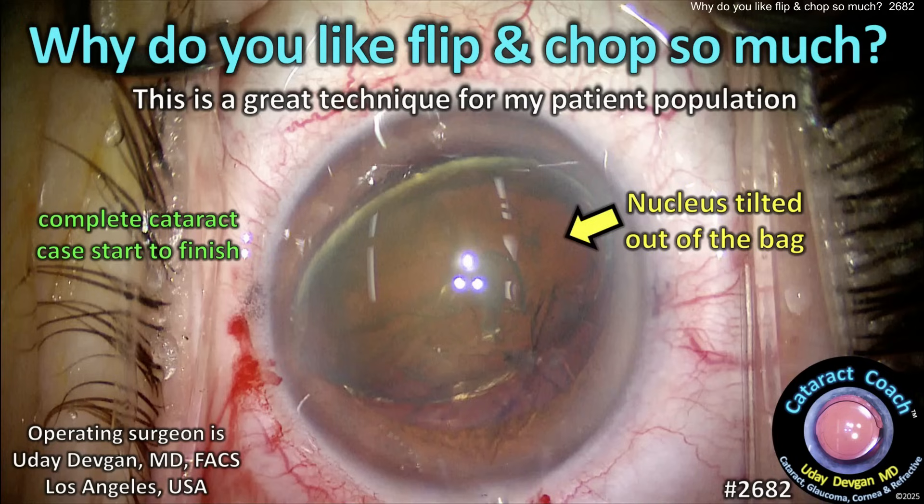Cataractcoach.com. Why do you like flip and chop so much? Well, the answer is it's a really great technique for my patient population.